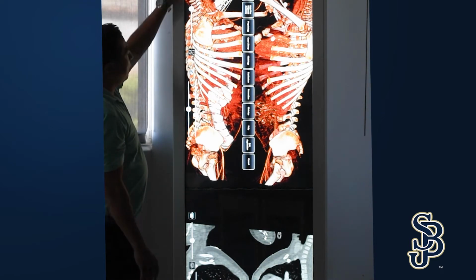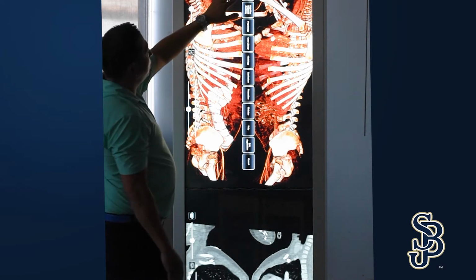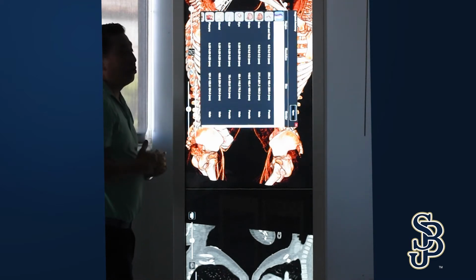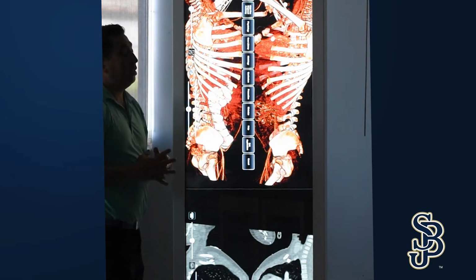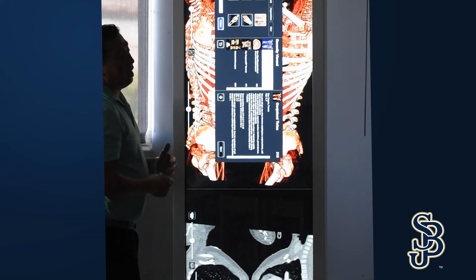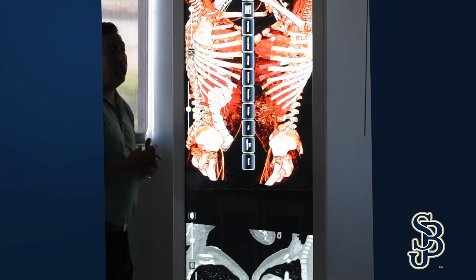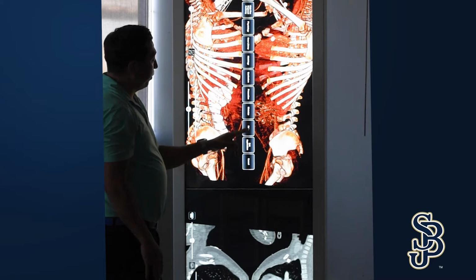Okay. So we also have some features like physiology. This is the main menu. You have the gross anatomy. There's 2 male and 2 female cadavers. And then you have the cadavers in high-res regional sections like head and neck, brain, organs, and different structures of the body like the extremities. And then we have our case library. So there's over 2,000 pathologies in here. And we also have 4 animal cadavers, dog, cat, frog, and mouse, and hundreds of animal scans as well.